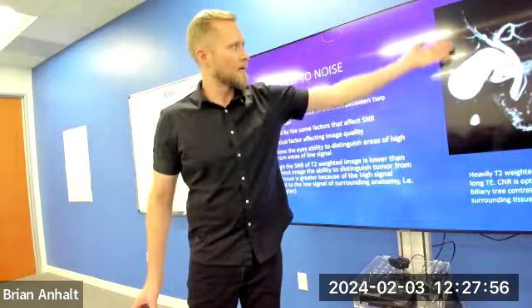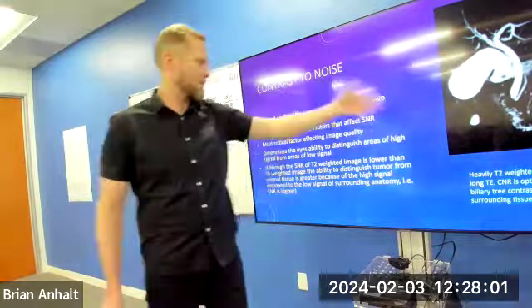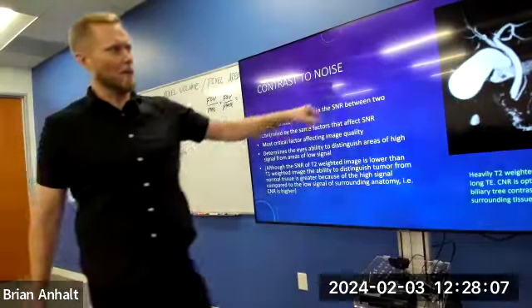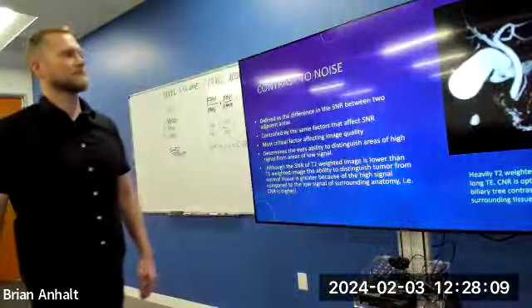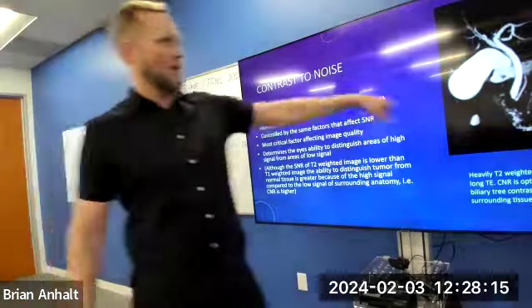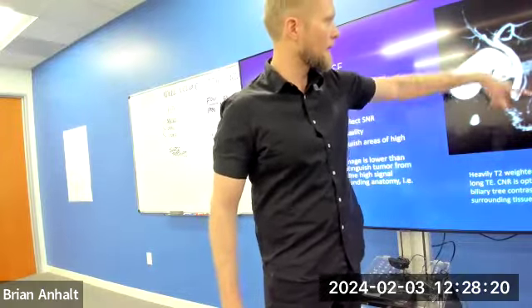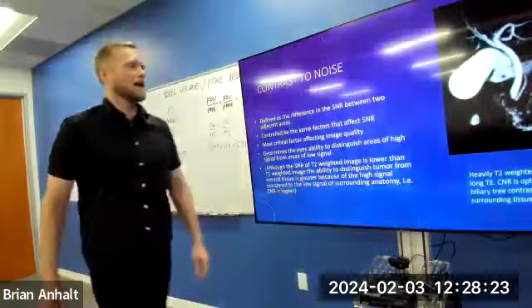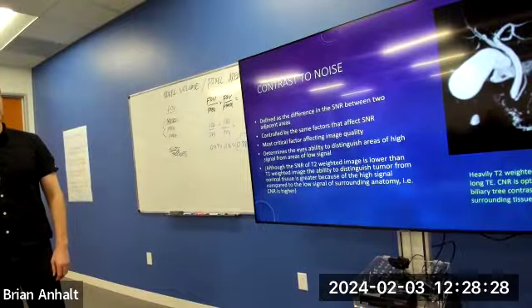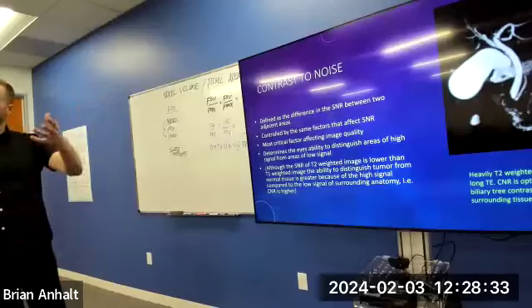Like right here, dark and white, right? Black and white, essentially, that's a lot of contrast. And these parameters are basically your TR, TE. You can see what's going on. Does anyone know what we're looking at here? Yeah, it's the biliary tree. It's an MRCP that we're doing. You're looking at the gallbladder. You see your pancreatic duct, hepatic duct, common hepatic duct, right and left, and then the common bile duct. But yeah, that is a scan in MR that we do. Heavy contrast that has a very high TE to make everything else dephase but keep the fluid still bright.